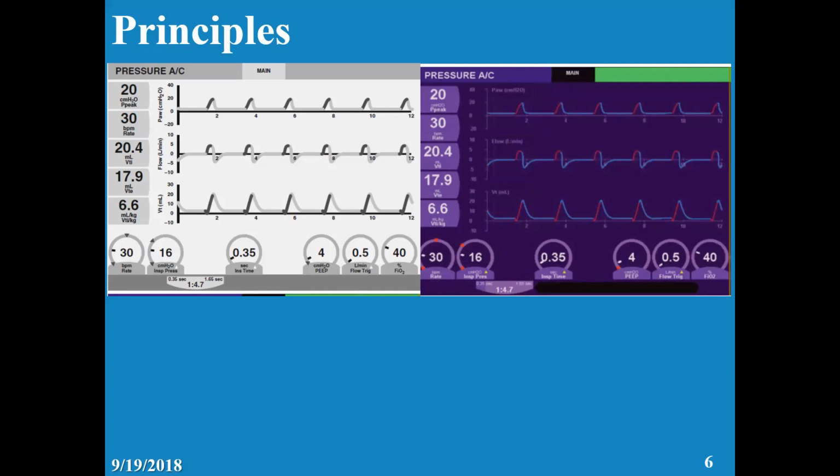Now the most important is the flow. You can see also here you have the set values or independent conditional parameters, and some of them are phase parameters. And you can see here the measured or the dependent conditional parameters, and you can see here is the graph. So we have numbers of 2 types, and we have the graph.